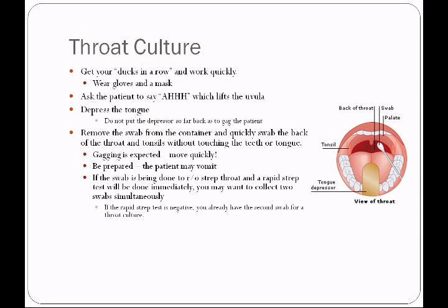If the swab is being done to rule out strep throat, and a rapid strep test will be done immediately, you may want to collect 2 swabs simultaneously. There are even transport containers that have 2 swabs stuck together so that you can do this.